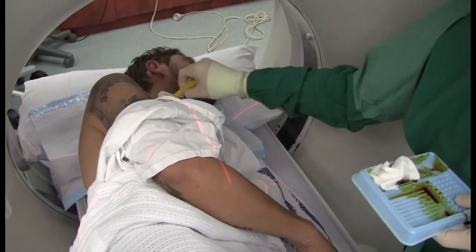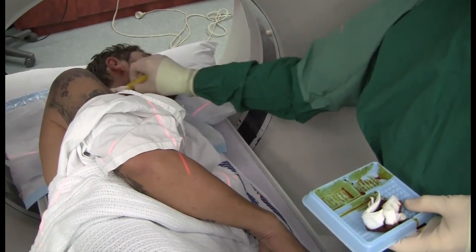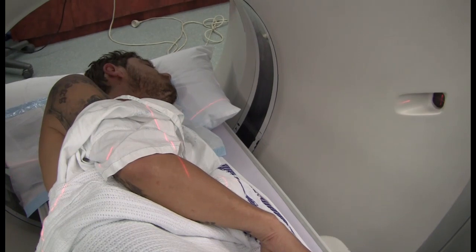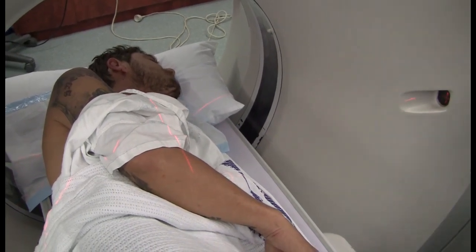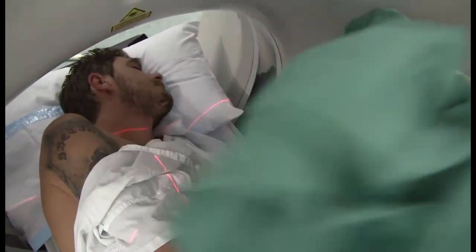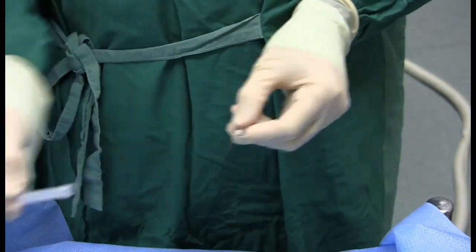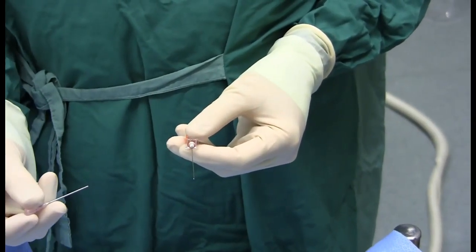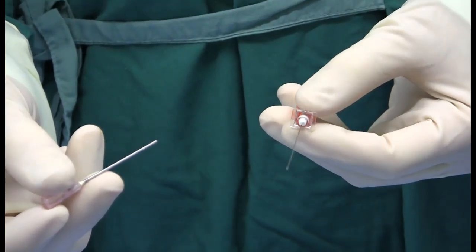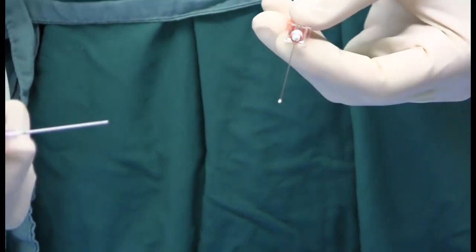We do it from in front — that way you've got room to get in between the patient and the gantry. Unlike the RFA case, with this case we are going in-plane, so we don't angle in. This is an iterative technique: we approach the right spot by placing the needle, tapping the pedal, checking the needle position, repositioning the needle, tapping again, and checking position — moving down to the right spot.